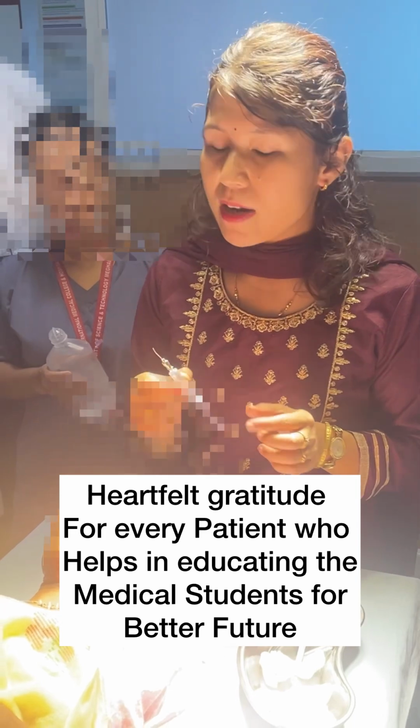For the lacrimal cannula, we cannot use a syringe with a sharp end, because it will cause injury. So it should be a blunt tip, okay. If it is too sharp, then you should avoid using it. The size of this cannula is small, so even without dilating, I can do the syringing. But what happens if it is bigger?